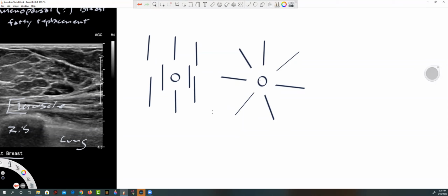So I've mentioned rad, anti-rad, sagittal, transverse. There are different methodologies. I like personally rad, anti-rad, but it doesn't matter what I like. Wherever we are working, the protocol there is the protocol we use.